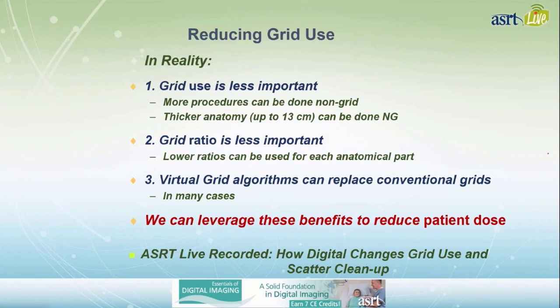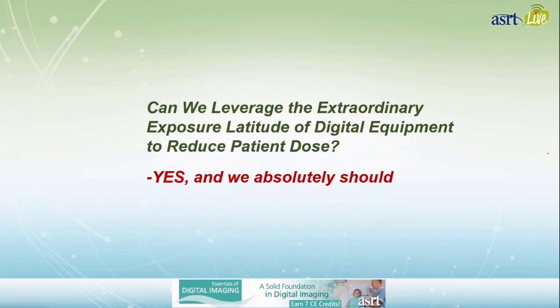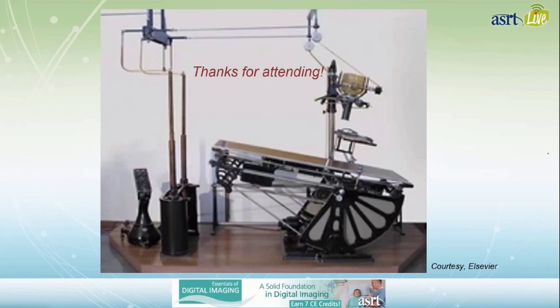And so I have an ASRT Live recorded presentation, and some of you may not be aware that these ASRT Live presentations are archived, and you can go back and simply look up this topic and go back however many months or years ago and watch these presentations. So I spent an hour on this one discussing grids and how we can reduce grid use. So can we leverage the extraordinary exposure latitude of digital equipment in order to reduce patient dose? I want to emphasize that I believe, and many of us believe, that yes, we can, and that we absolutely should.